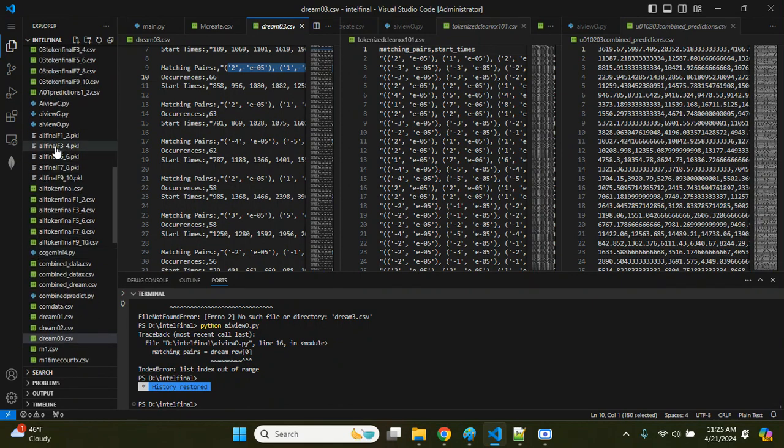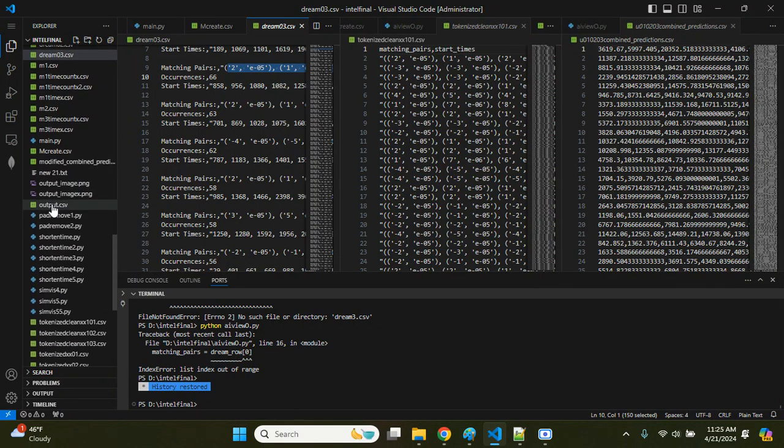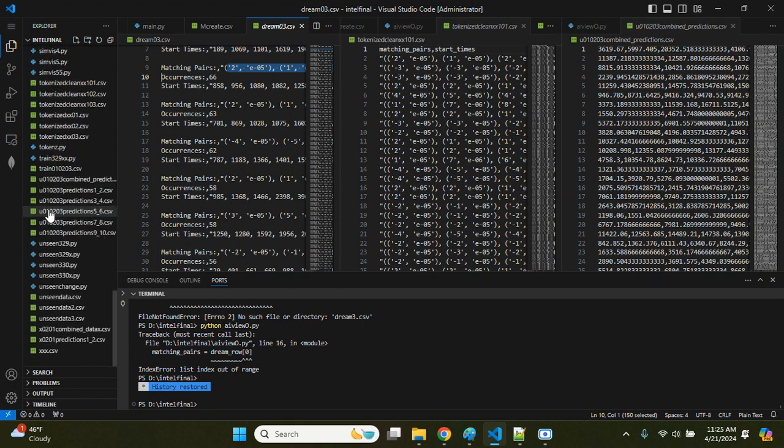The sleep data is more vast because you sleep for longer periods of time and you have different sections of sleeping. So you have different, vast data when you sleep than just sitting there wearing a head thing and thinking of things. So you have to really look at your data before you analyze it and know your data 100% before you take any steps into it.